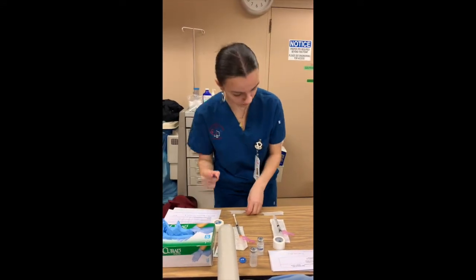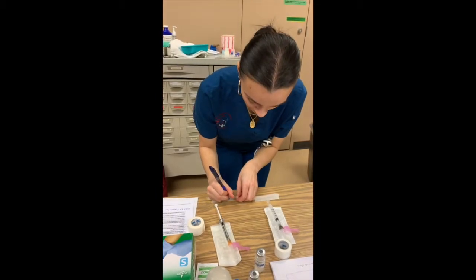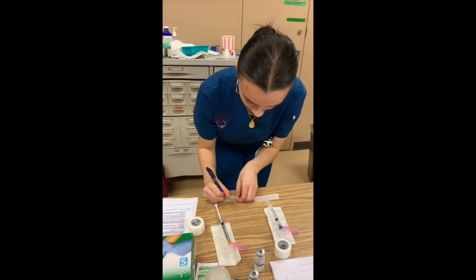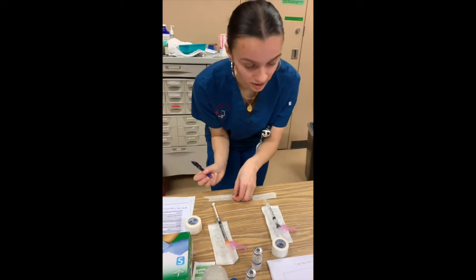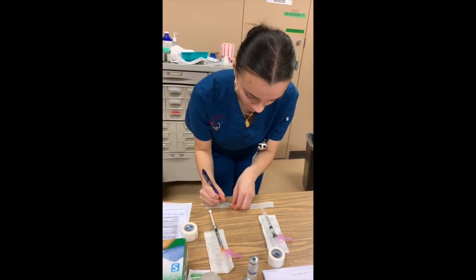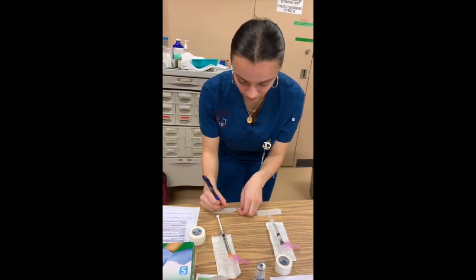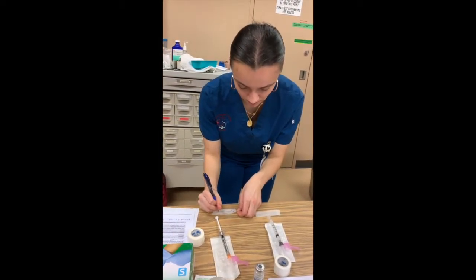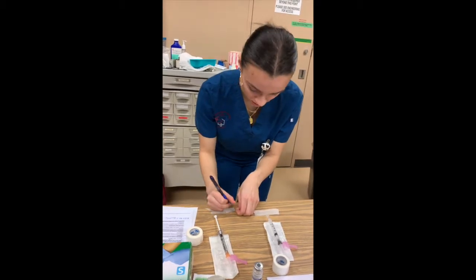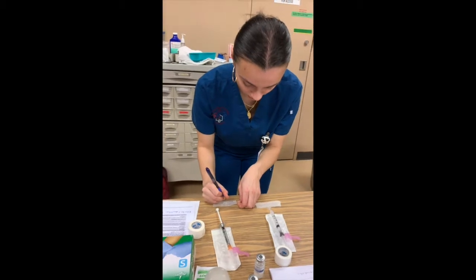So what I would do, I'm going to write Mr. Mancini, his name first. I'm then going to be writing the actual drug, so it is the heparin. Okay, and then I'm just going to write the subcutaneous just on there. And then I'm going to be writing the dose, 5,000 units per the 1 milliliter.